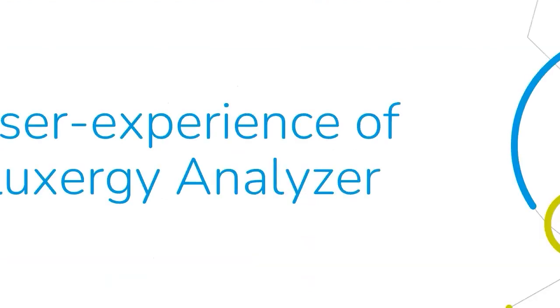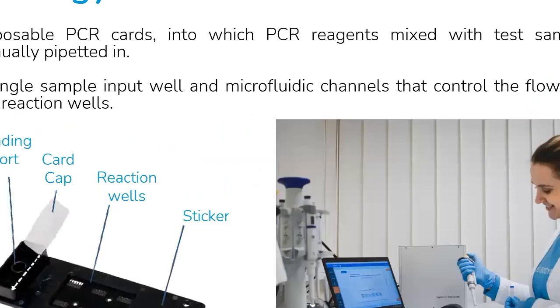First, what was our user experience of the Fluxergy Analyzer like? Fluxergy uses disposable PCR cards, which I find labor effective, since they have only a single sample loading port. This is especially useful in case there is only one specimen at a time to handle. The single port is then connected to microfluidic channels, which direct the sample and PCR reagents into 6 reaction wells. This conveniently results in multiple technical replicates.